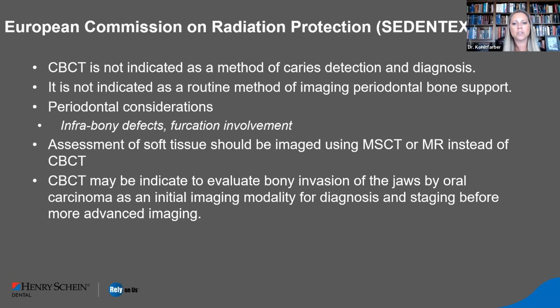Assessment of soft tissue should be imaged with, I would say, MRI ideally, and medical CT if necessary. But MRI is not using ionizing radiation, and so I tend to like that one better. CBCT may be indicated to evaluate bony invasion of the jaws by oral carcinoma.